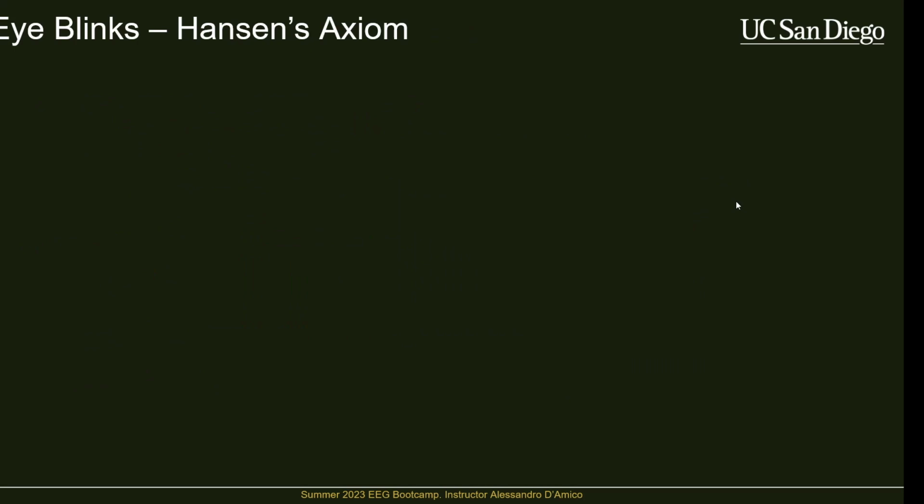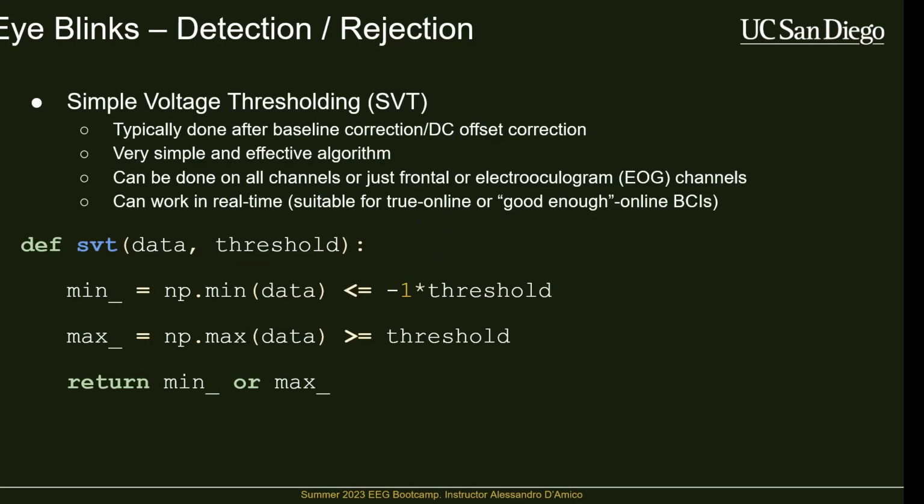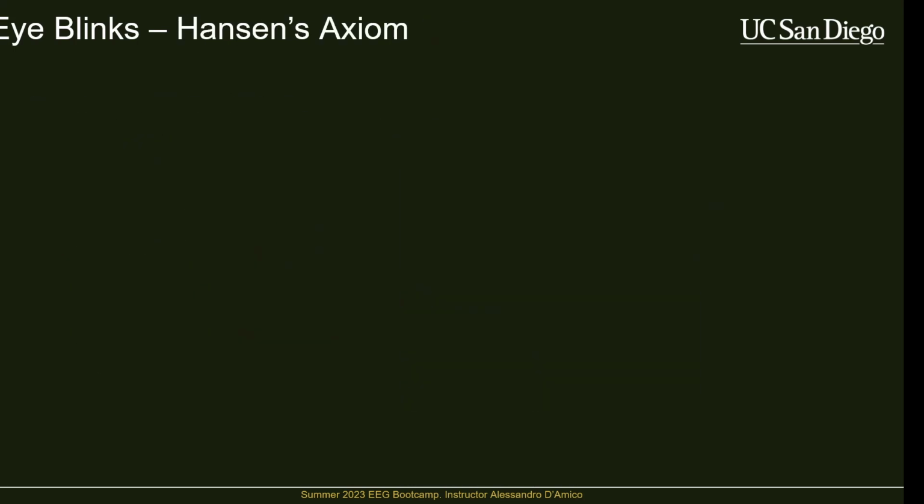So this will be the last slide. So that's how we can deal with it with computational techniques. How can we deal with eye blinks using first principles? If subjects are wearing contacts, have them wear glasses instead. So if anybody here wears contacts and wants to collect their EEG data tomorrow, please wear glasses.